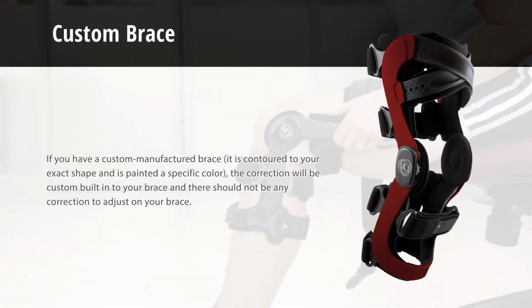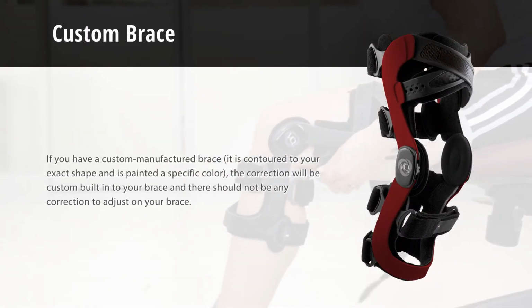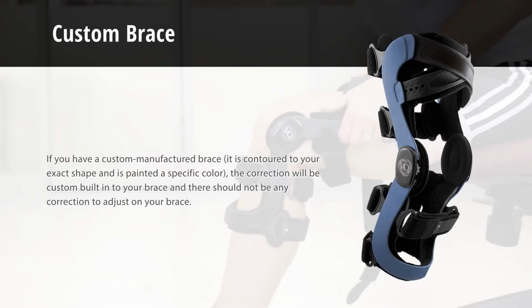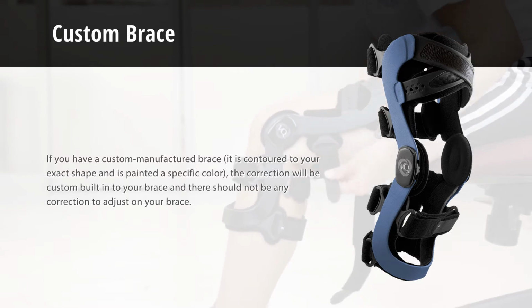If you have a custom manufactured brace, it is contoured to your exact shape and is painted a specific color. The correction will be custom built into your brace, and there should not be any correction to adjust on your brace.